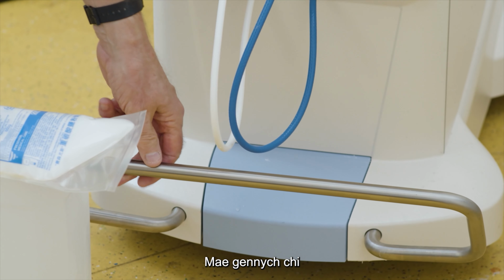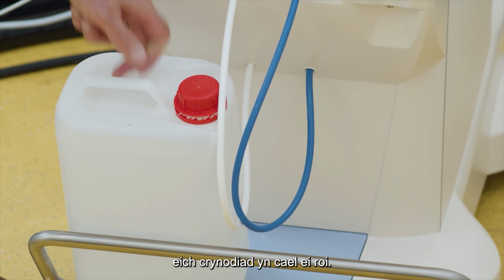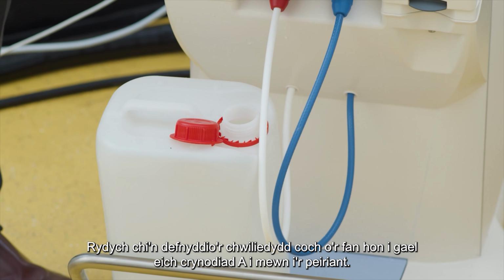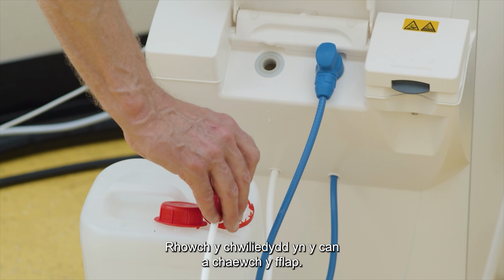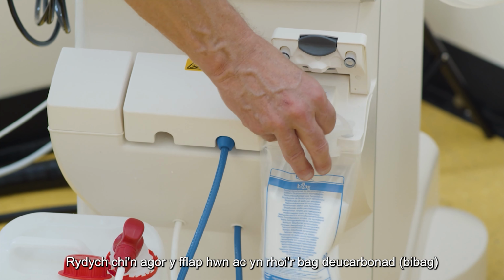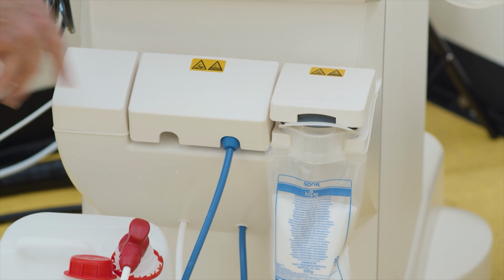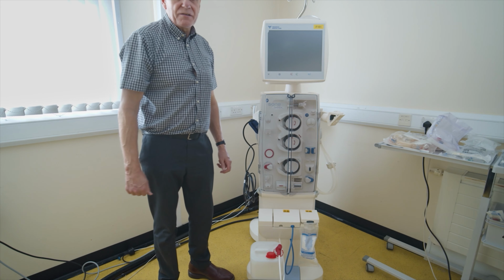You have this shelf here, which is where your A concentrate sits. You use the red probe from here to get your A concentrate into the machine. Open the flap, put the probe in the can, close the flap. You open this flap and you put the bag on there and then close the flap like that. You do not use the blue probe. That's not used on this machine.